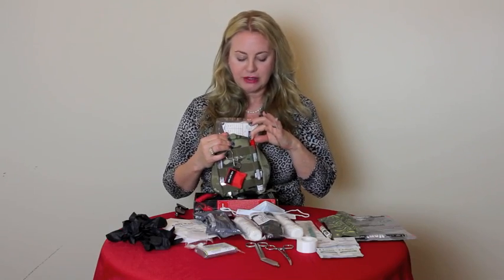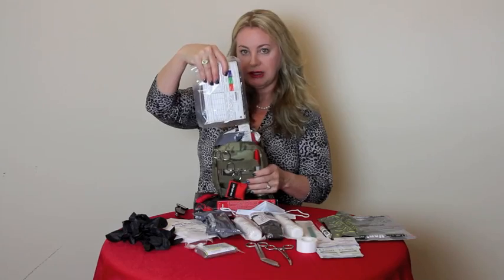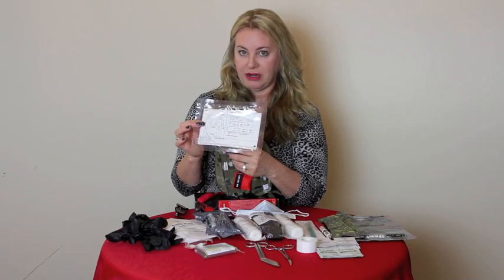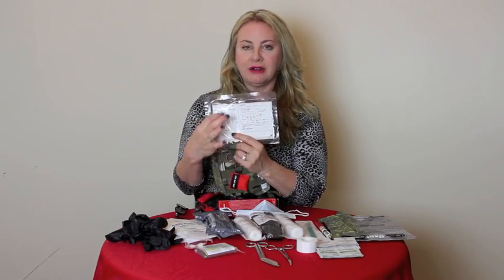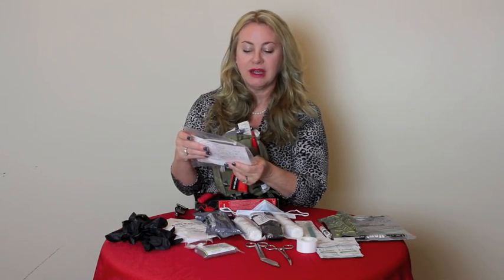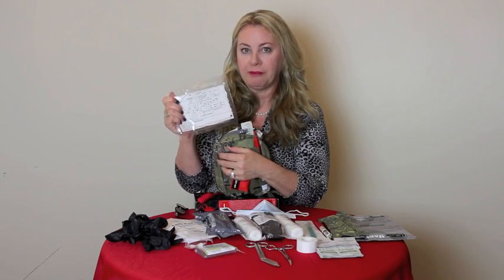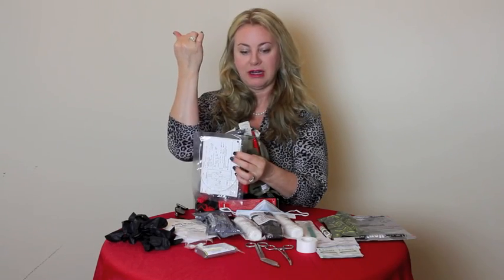Also on the outside, you're going to see a red marker. When you open up your kit, this is loosely within. You can choose to fill out, after you have finished taking care of the patient, what actually happened? Where was the injury? What were the vital signs? What did you do to the patient? Did you put on a tourniquet? What actually did you perform? This can attach to the patient with a bracelet right here.